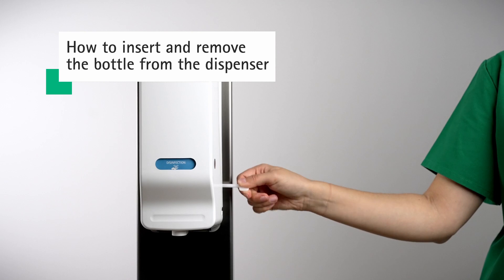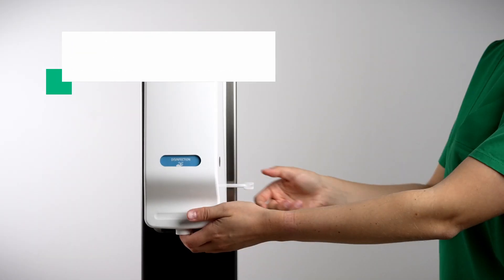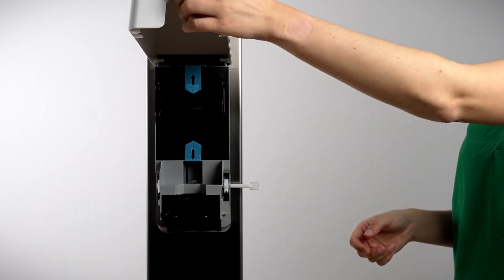Once the opening date is recorded on the label, peel it off the bottle and stick it onto the wall dispenser in a visible position. To open the cover, turn the key clockwise until you hear a click. The cover of the dispenser will come slightly toward you and can be opened.